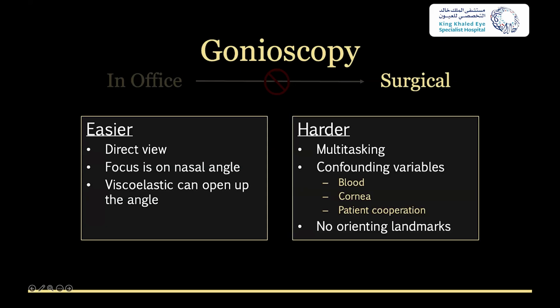But there are a lot of things that make surgical gonioscopy harder. The biggest thing I find is that you're multitasking. In the clinic, your full focus is on getting a really good view of the angle.